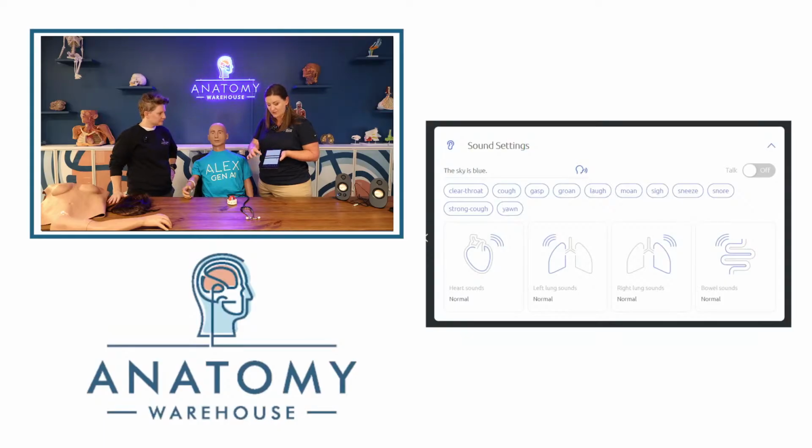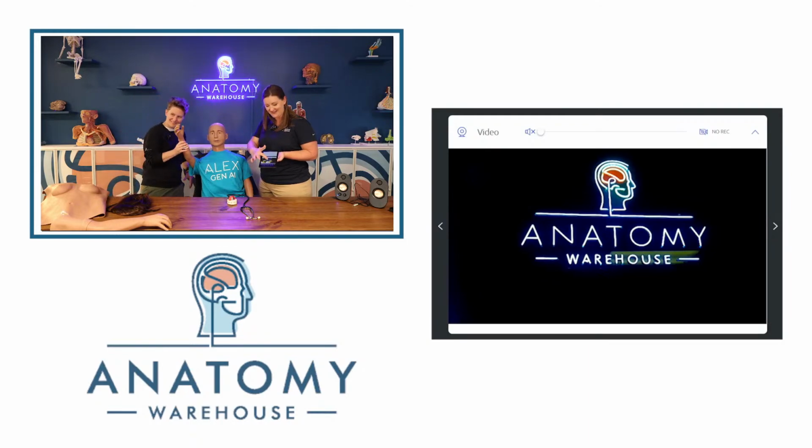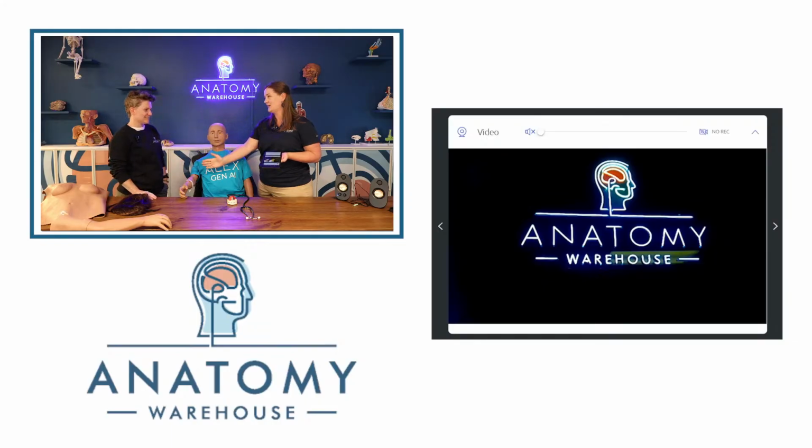The other thing that we talked about too was that not only does Alex hear and respond, but he also sees. So Alex is currently watching our cameraman back there. Wave to Alex, Matt. So, his iris camera is live feed, so again, the differences in those software platforms is the ability to record and how long and how much recording that they can do with that iris camera. So again, those soft communication skills, very important.